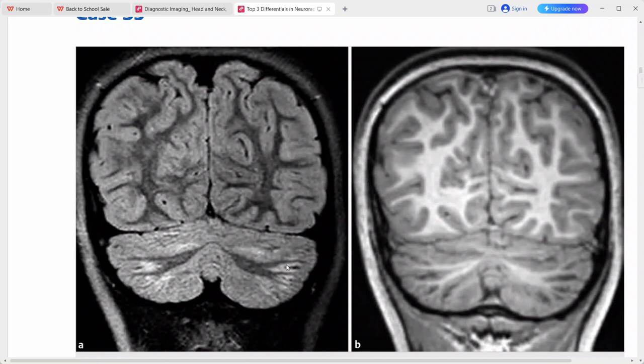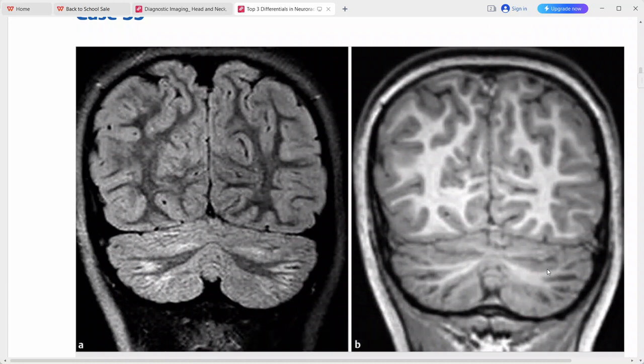Considering the diffuse abnormal cerebellar signal — FLAIR hyperintense, T1 hypointense, no enhancement — the top differential is cerebellitis. Other differentials include demyelinating processes like MS or ADEM, or infiltrating neoplasm.